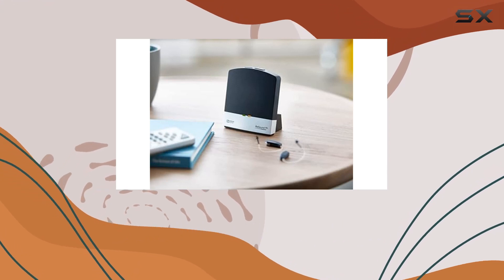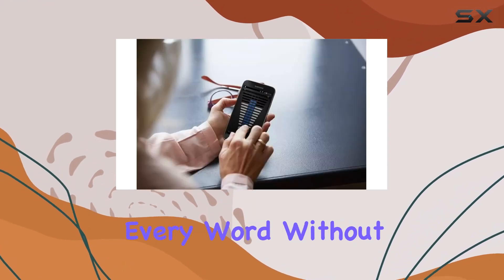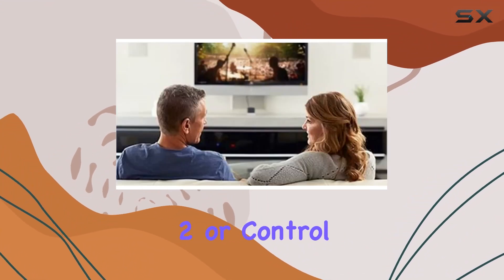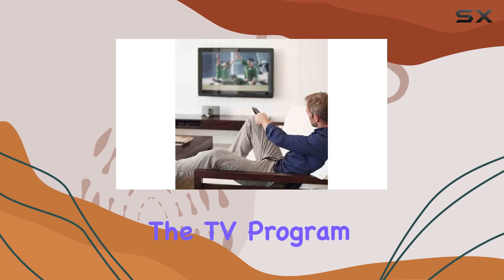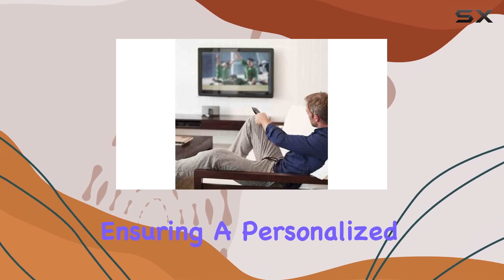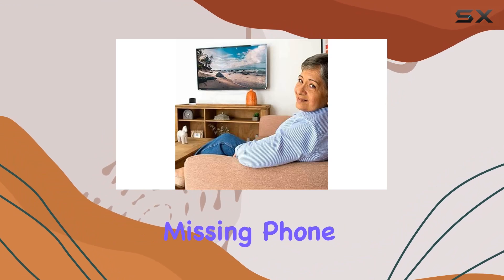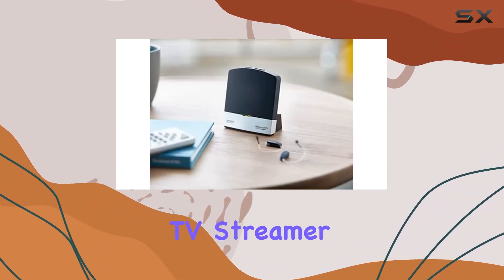The ReSound TV Streamer 2 lets you adjust the volume of your hearing aids independently, so you can hear every word without disturbing your loved ones. The Remote Control 2 or control app gives you the power to fine-tune both the TV program and your hearing instruments, ensuring a personalized and comfortable listening experience.